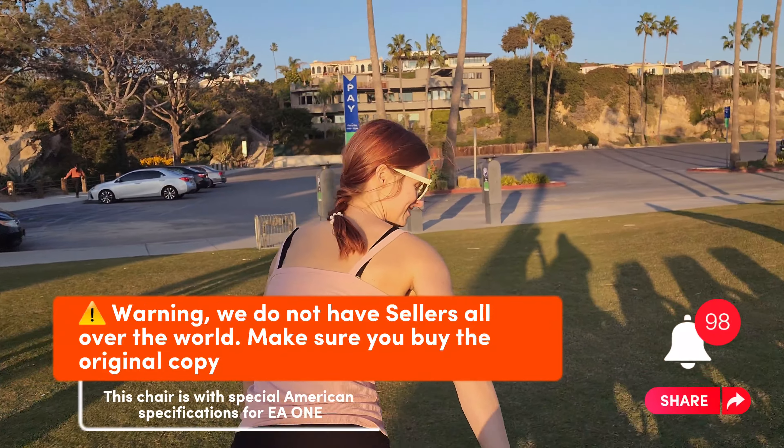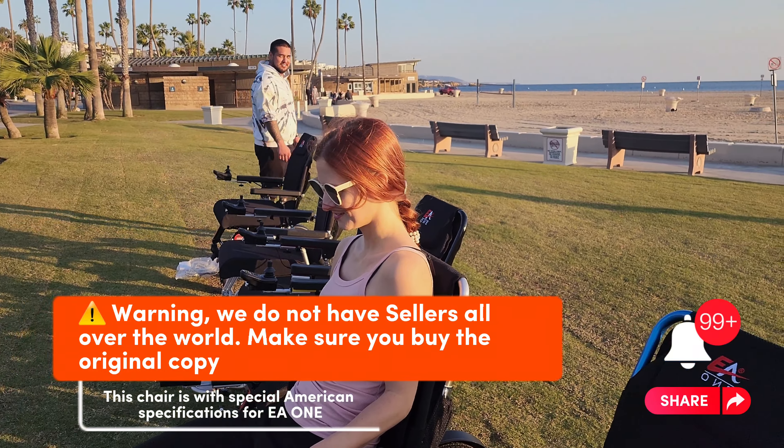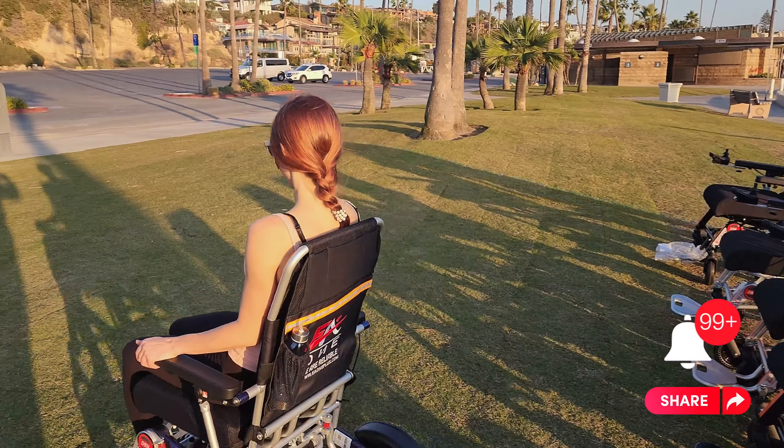Warning: we do not have sellers all over the world. Make sure you buy the original copy. This chair is with special American specifications for EA1.